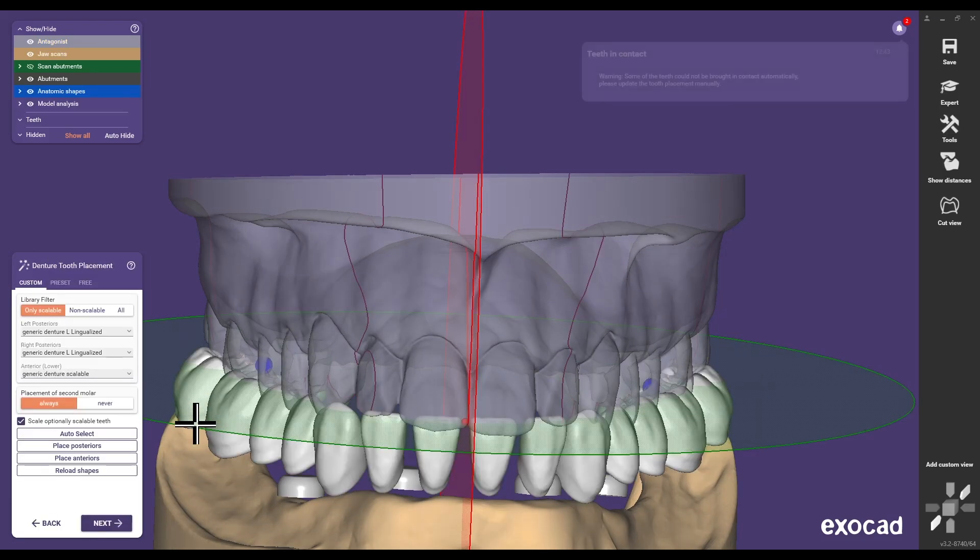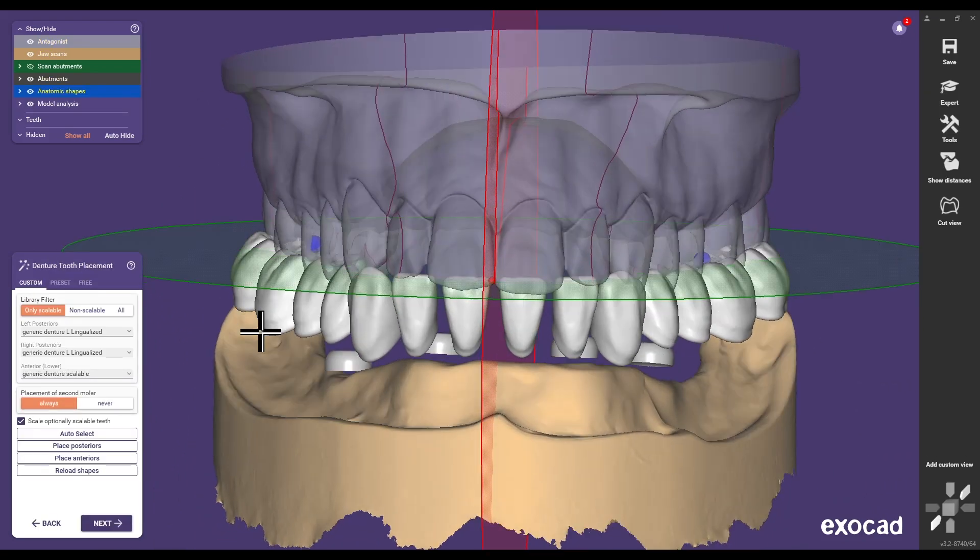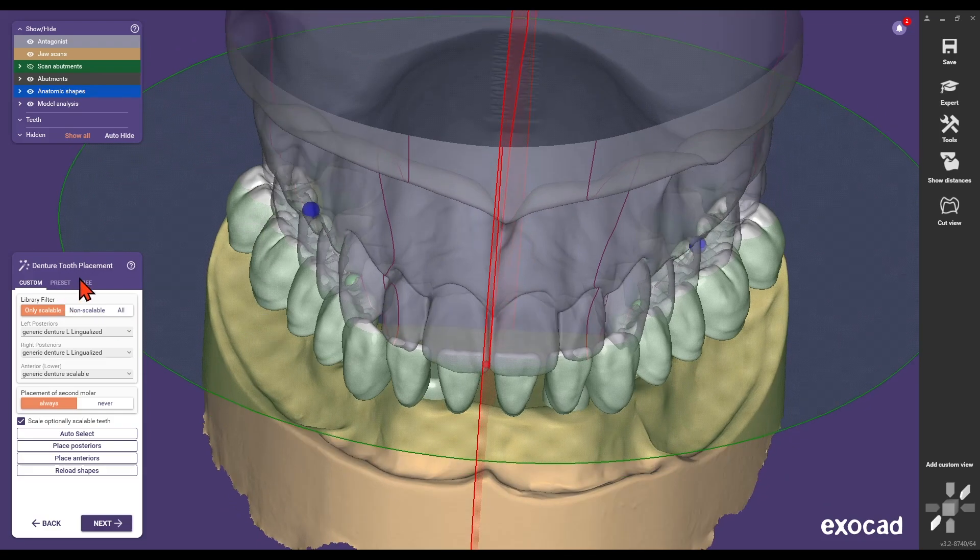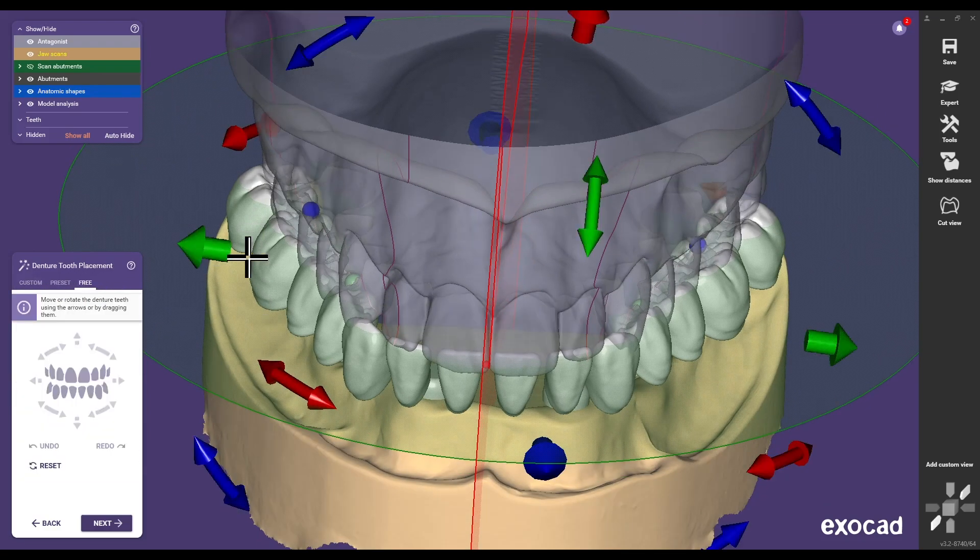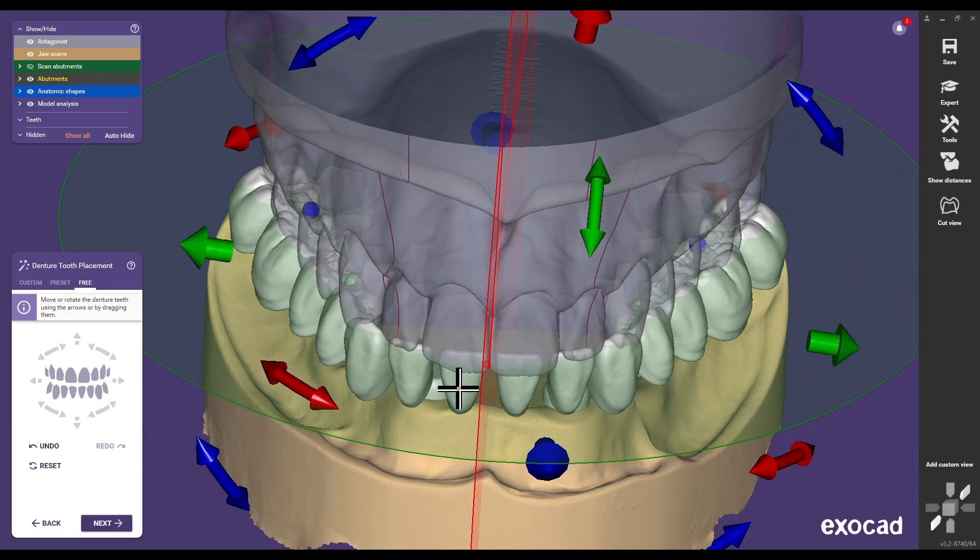Adjust the ExoCAD design proposal to meet individual dental requirements. Rotate and move the entire tooth chain as needed.